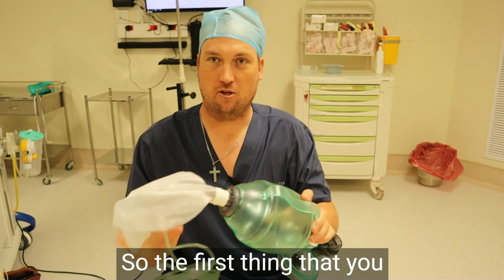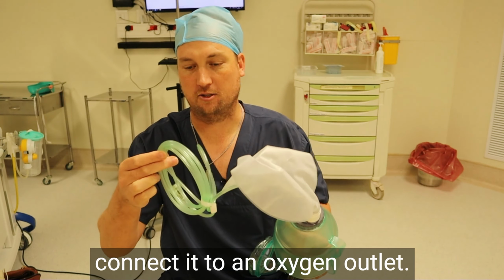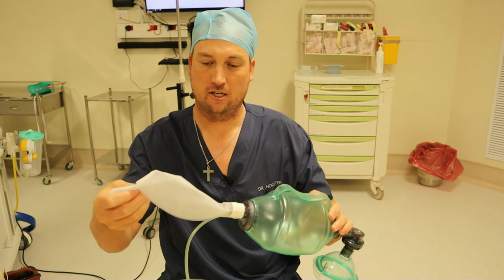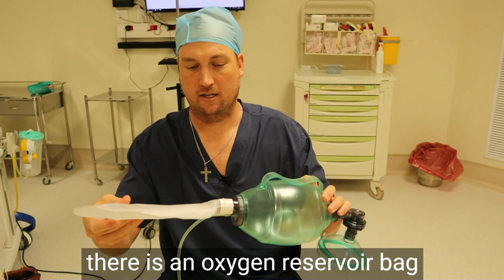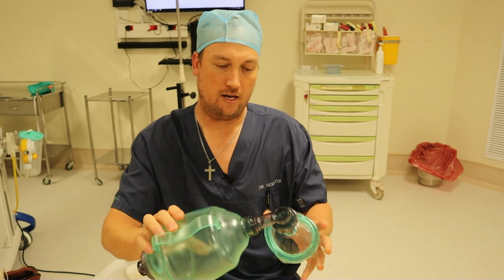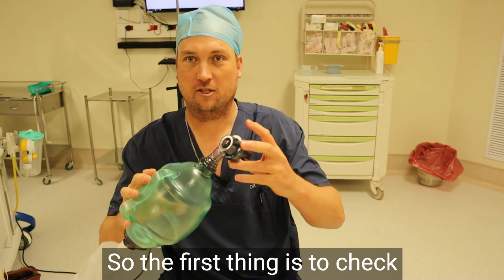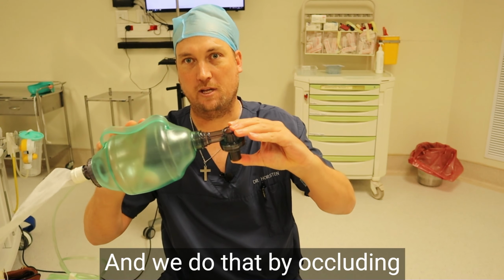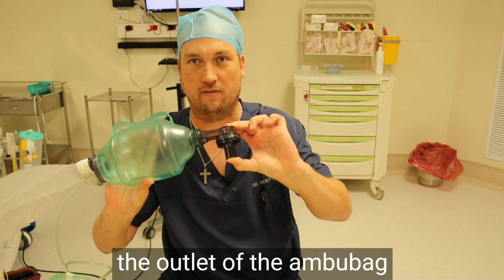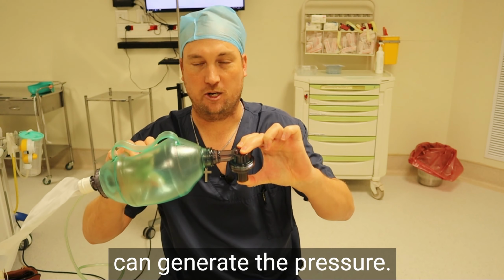So the first thing that you want to check is that you have oxygen hosing so that you can connect it to an oxygen outlet. You then want to check that there is an oxygen reservoir bag at the back of the ambu bag. And then we're going to actually check the workings of the ambu bag. So the first thing is to check that you can generate a positive pressure. And we do that by occluding the outlet of the ambu bag and then squeezing the ambu bag and seeing that we can generate a pressure.